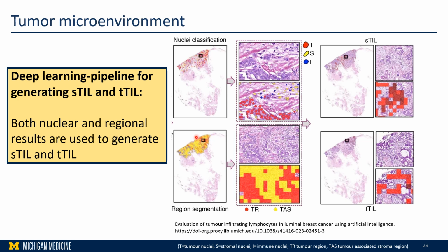As you see right now, the key measurements include quantification of the tumor area, the segmentation, the ratio of tumor to epithelium or to stroma, and the presence of the TILs within the tumor and in the surrounding area, and subclassifying them.